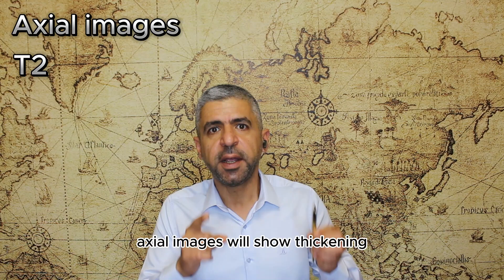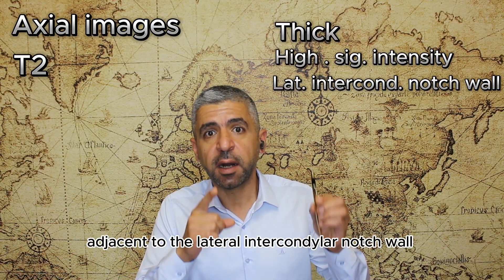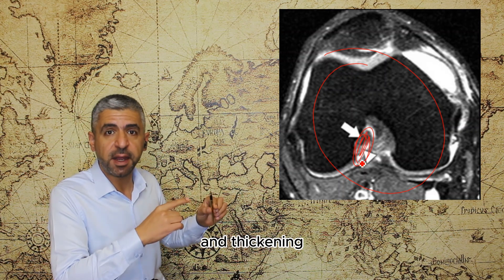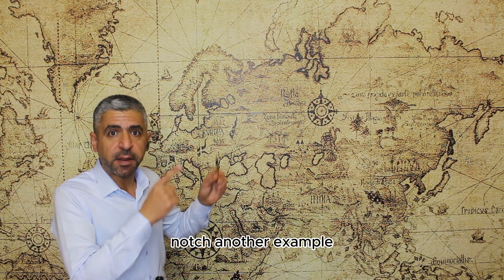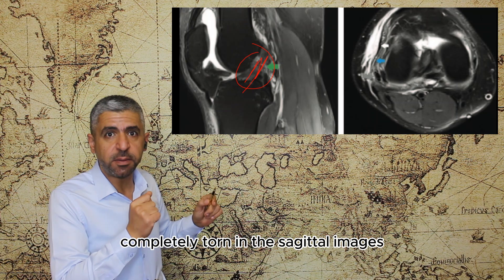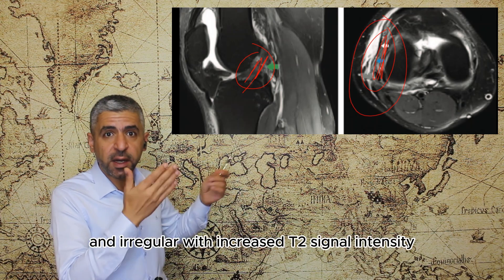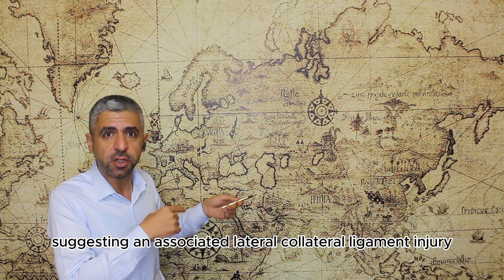On axial images, thickening and increased signal intensity adjacent to the lateral intercondylar notch wall is seen. For example, this axial image shows partial ACL tear with increased signal intensity and thickening adjacent to the lateral intercondylar notch. Another example shows a completely torn ACL on sagittal images, with axial images demonstrating an edematous and irregular lateral collateral ligament with increased T2 signal intensity, suggesting associated lateral collateral ligament injury.